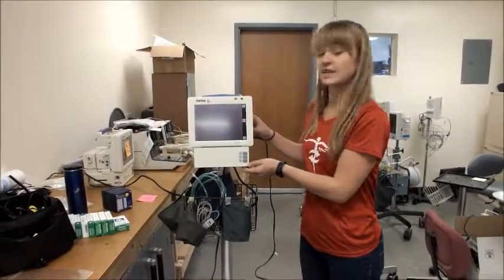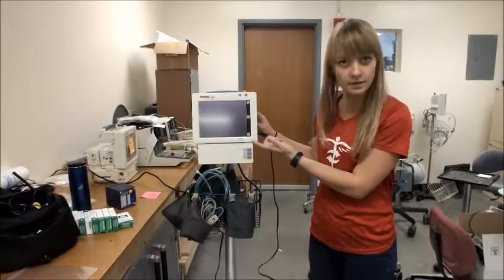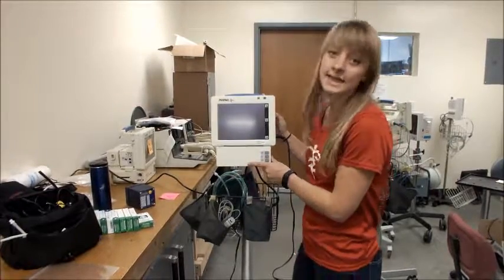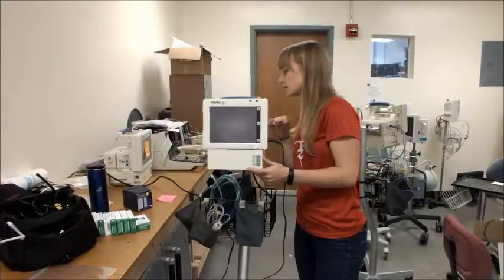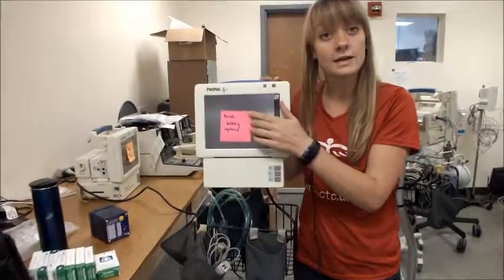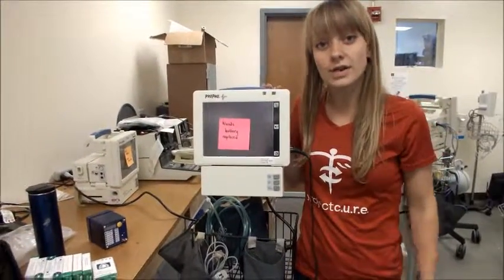Sometimes when we plug the machine in and turn it on, it gives a beeping noise or the screen doesn't turn on. If that's the case, the battery is probably dead. Leave a sticker that says low battery or needs battery replaced and return it to where you found it.